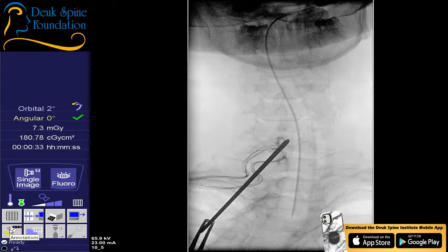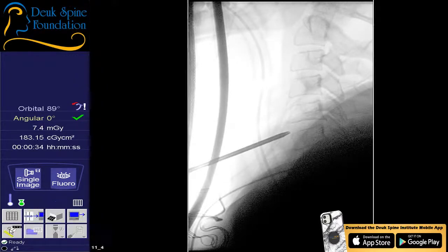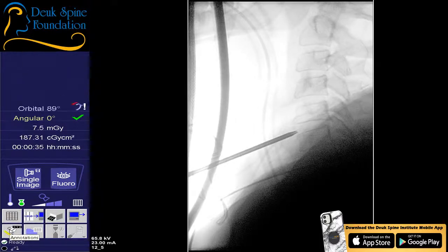All right, let's go back to a lateral. Shot. All right, so I need that back in a second. We don't need that yet. Don't even bring it to me. Shot. All right, now I need an AP. Oh, no, you hit something and it slipped. So let's give me a lateral. And don't hit the table, please. All right, back to an AP. You're not allowed to hit the table. That's clumsy. We don't do clumsy stuff here.